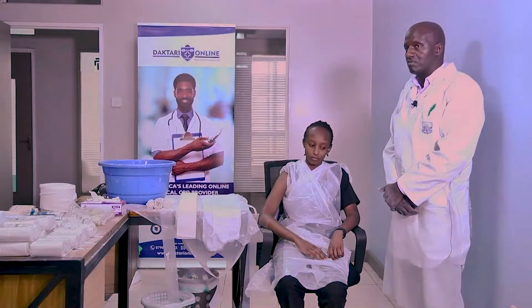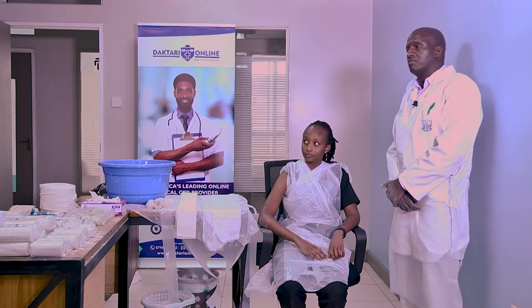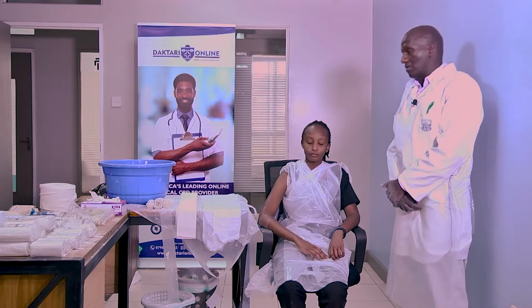We have Cynthia here who has agreed to be our patient and model today for demonstration purposes, and we have Zach Humingich who is our expert in applying casts. He will demonstrate how to do this. Over to you.